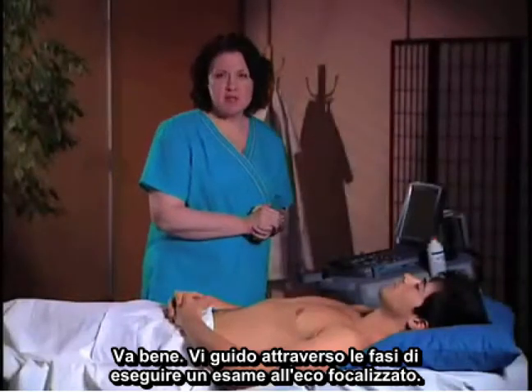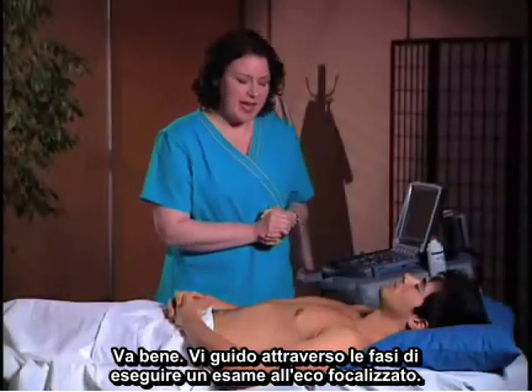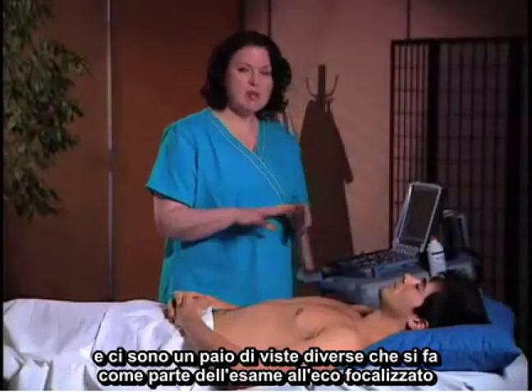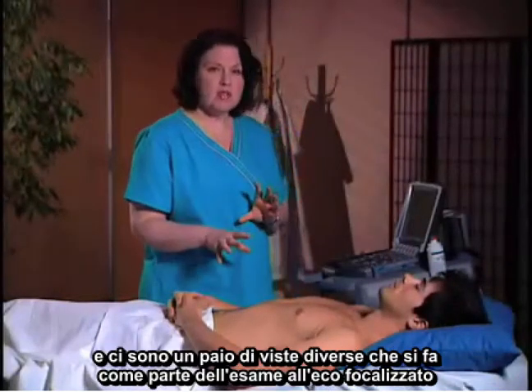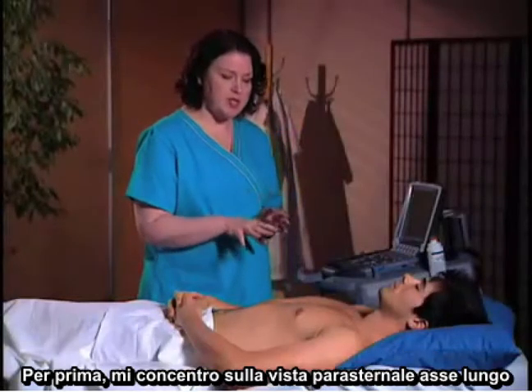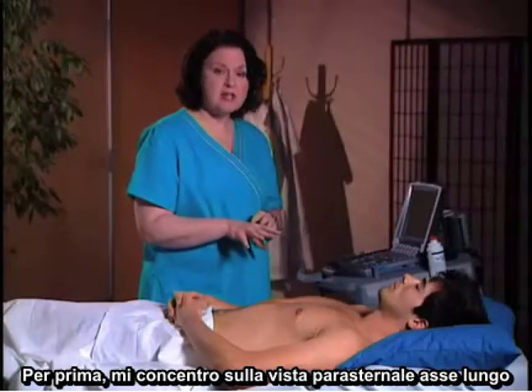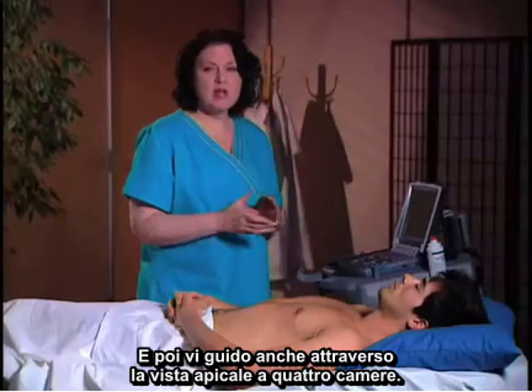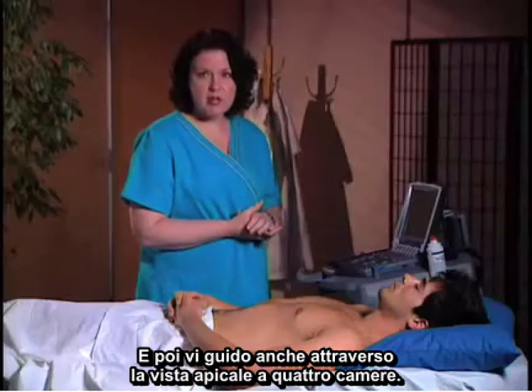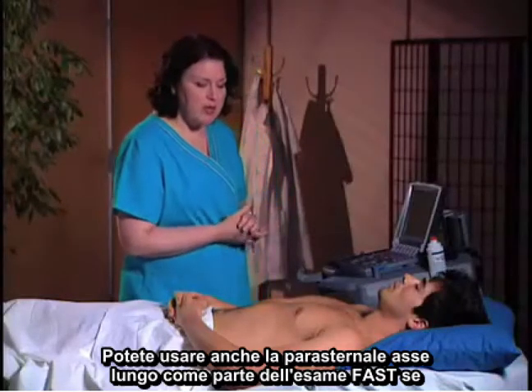I'm going to walk you through the steps of doing a focused echo exam. There are a couple of different views that you do as part of the focused echo exam. I'm going to concentrate first on the parasternal long axis, and then we'll walk you through the apical four-chamber view as well.